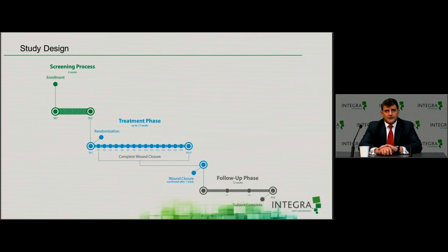Then over the next period of time, they underwent the treatment phase up to 17 weeks. This usually was started with one application and then just was followed over time. And we'll comment on that: the majority of these patients, 72%, only had one application of the product. These are the patients that closed, I should point out, had one application of the product. And then a follow-up phase that went out to another 3-month period.